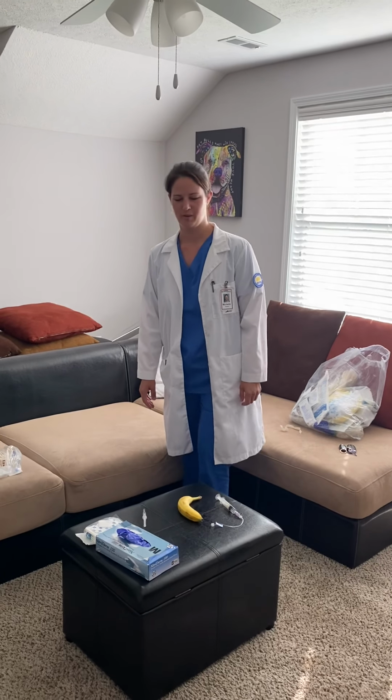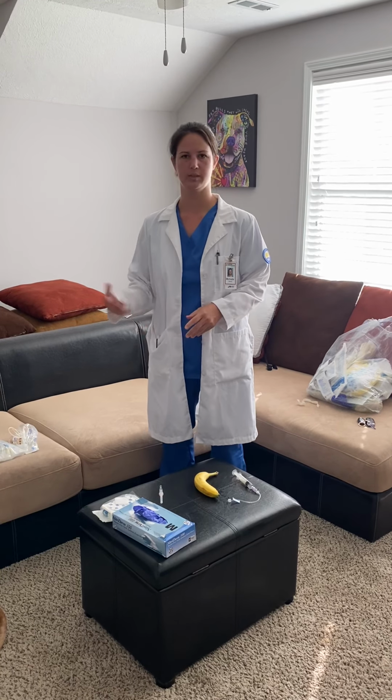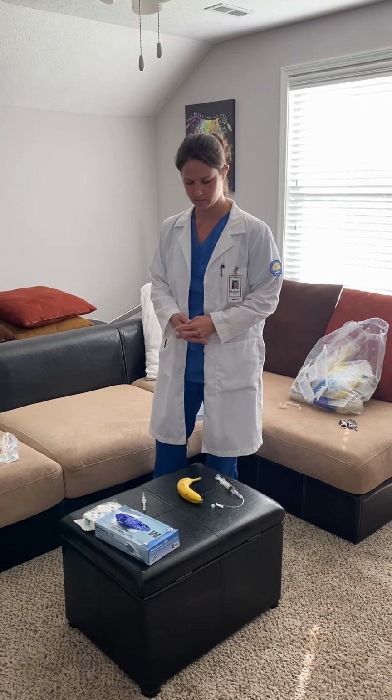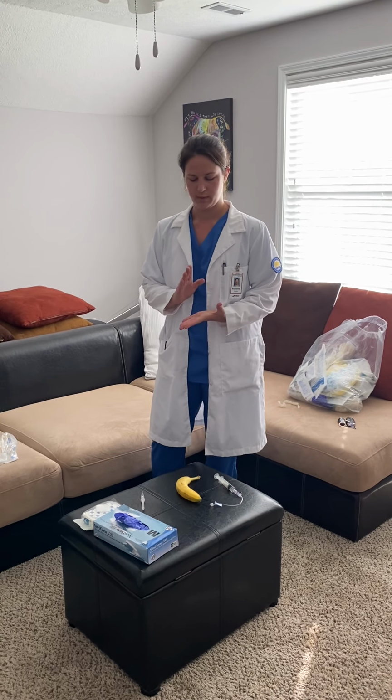Hi, my name is Michelle Walker, and I'm going to be doing an IV insertion today and doing an IV push with medication, as well as administering IV fluids after that. Our patient today is Mr. Banana, and we are going to start off with the 12 steps.